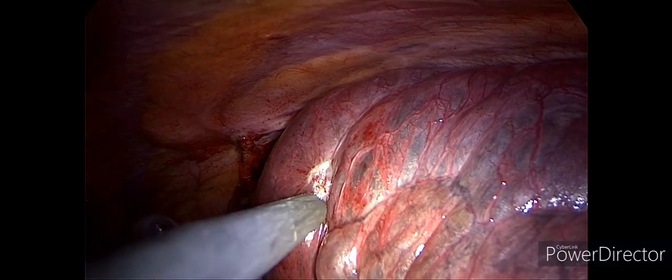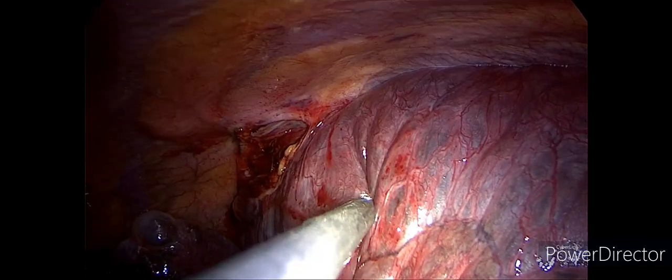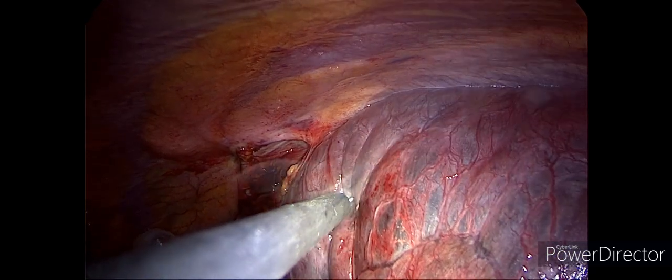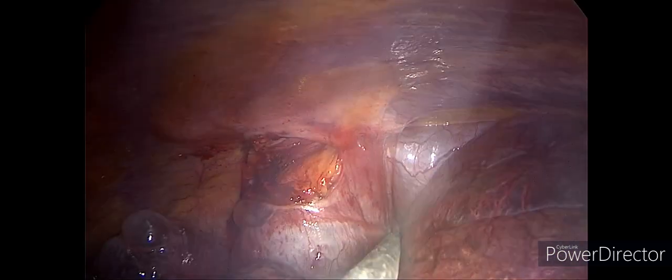Because of his morbid obesity and small intercostal spaces, we decided initially to just rupture the bulla. It will give us more space to work.